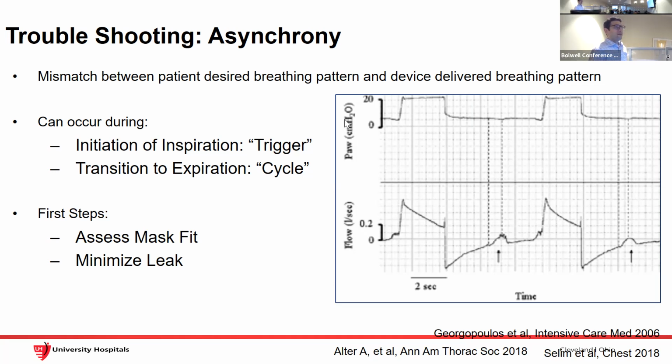Right? On the other hand, I think what you have to think of is these are the things you're trying to do, and that's what you're trying to show. So before I talk about VAPs, let me give you an example. It took me a long time to find this particular tracing, so let's take it slow. On the top, you have airway pressure. This is the pressure if you're looking at your CPAP or BiPAP pressure. Let's say bilevel pressure, or you have your EPAP. Let's say the patient's on 20/4.